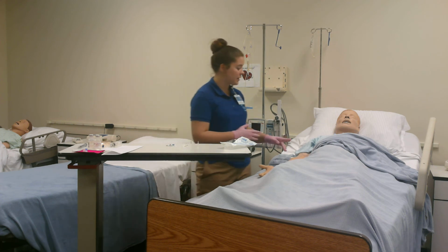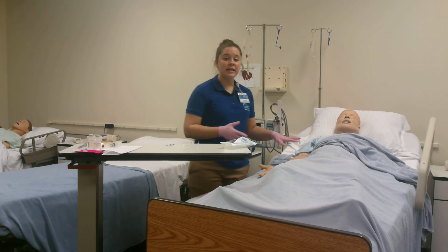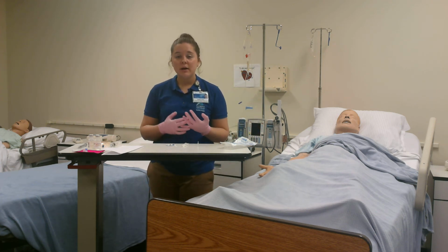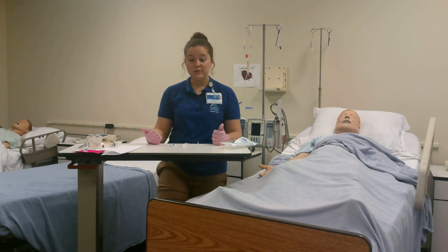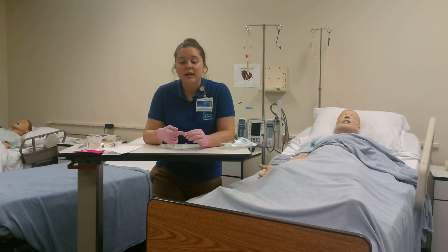I'm going to monitor for any signs of swelling, pain, edema, tenderness, redness, and any adverse allergic response, and we see none. And now I'm going to document in my MAR. I'm going to record the time, the date, the drug, the route, the dose, and the condition of the IV site.